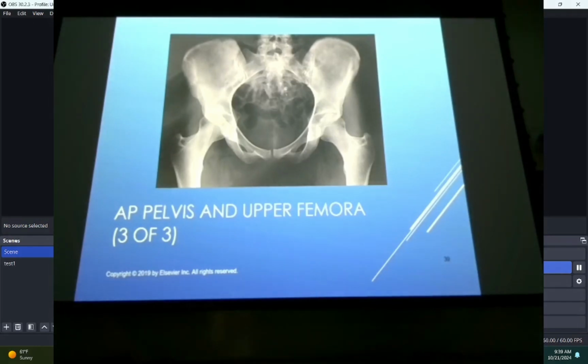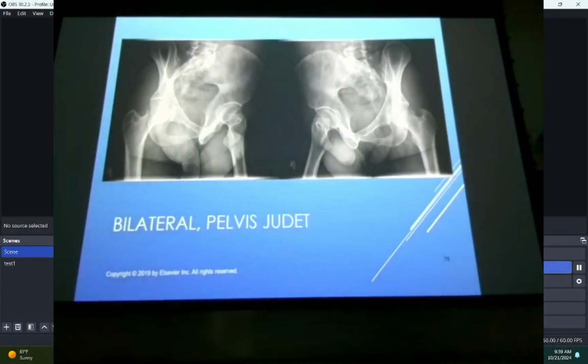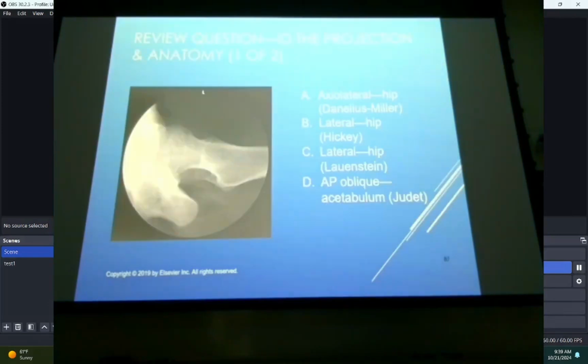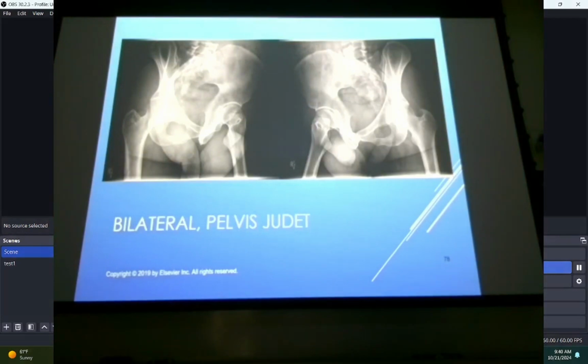So in some cases, you can have such an unstable pelvis that you don't want to rotate the patient around, but you still have to see where the fractures are, right? So let's now go back down. That's the original Judet views, and what we do. Okay, I thought I had some inlet and outlet views, but I don't. So look on page 414. If the patient is so unstable that they can't rotate for Judet views, then we still have some options.